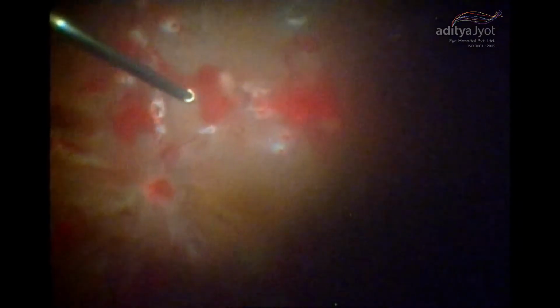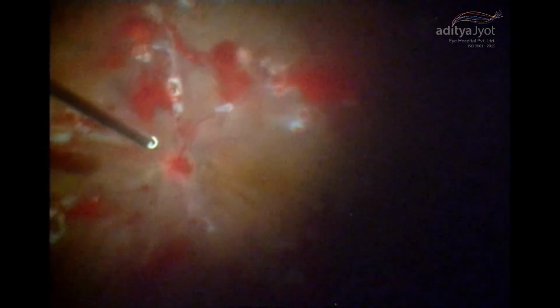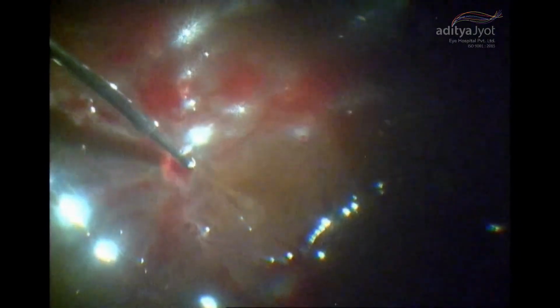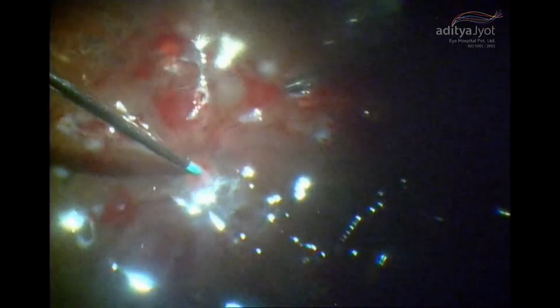And now you see this fluid air exchange being done, and this is a view under air, and making sure that totally the vitreous cavity is dry using the retinal brush. Make sure that all the oozes are stopped, and then you complete it by doing endo laser photocoagulation.